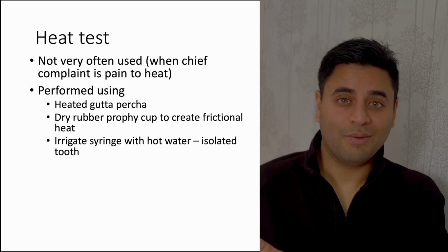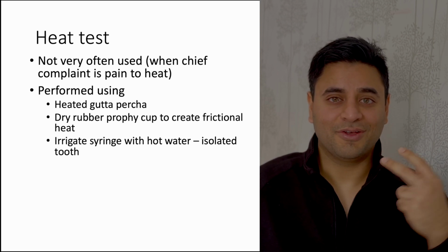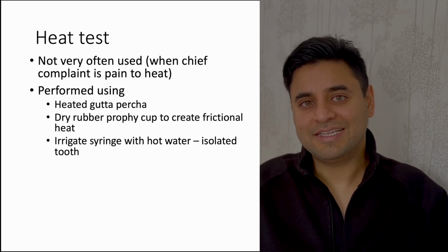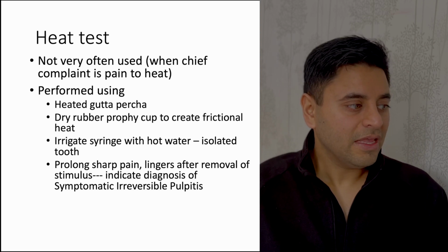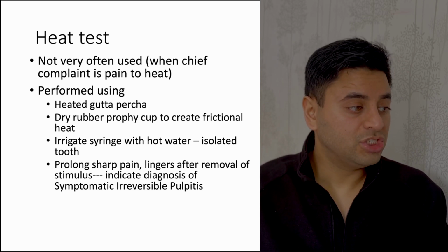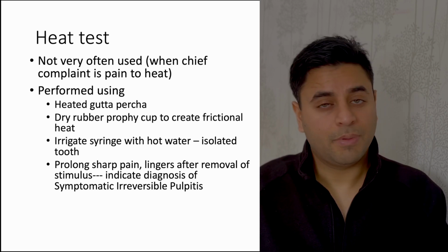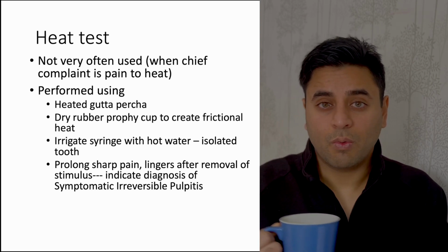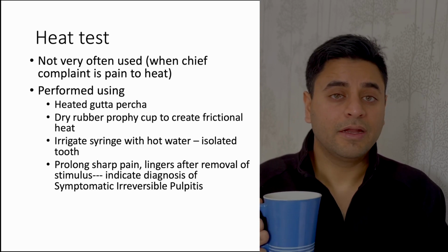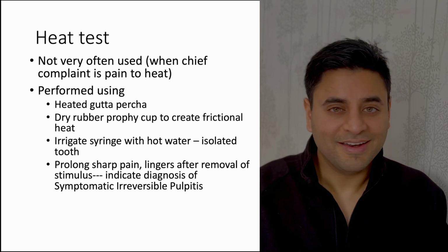If there is no tooth mesial or distal to it, just one lone standing tooth, then yes, you can perform a heat test using hot water irrigation. If the patient says prolonged sharp pain which lingers even after removal of the stimulus, it is indicative of symptomatic irreversible pulpitis. I'm just throwing it in there because it was asked in one of the questions in the national boards, but I will discuss symptomatic irreversible pulpitis in more detail later in this course.